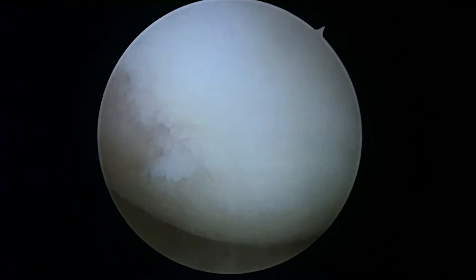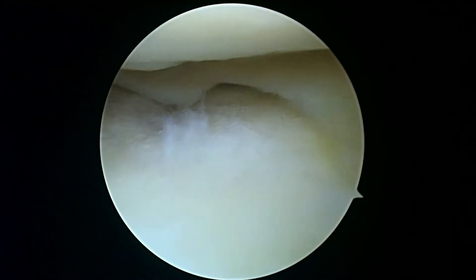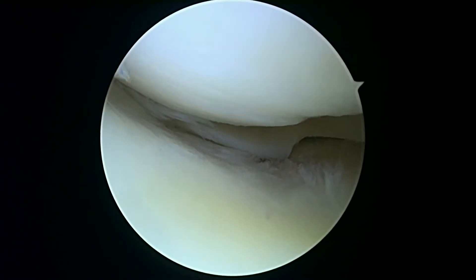This is the medial side again. As you look at the cartilage, you can really start to see how different it is where it's rough compared to where it's nice and white and smooth. Next, we're going to look in the lateral compartment. Even right out of the gate, we can see there's some thinning of the cartilage on the plateau below. We're going to reposition the knee and get a good look at the condyle.